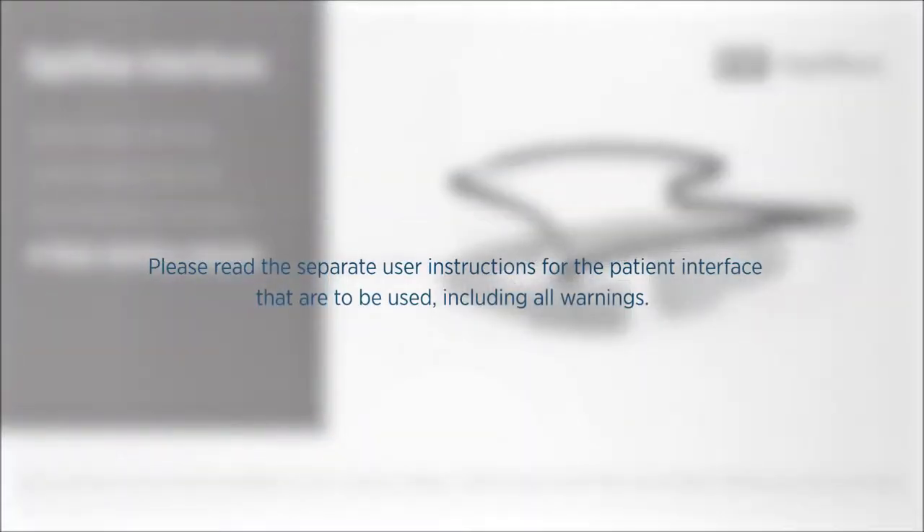Please read the separate user instructions for the patient interface that are to be used, including all warnings. These accessories need to be replaced for every new patient.